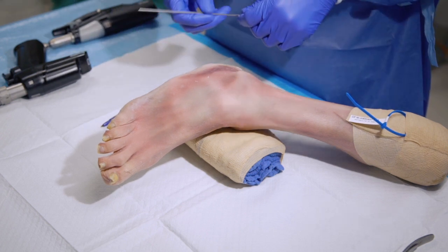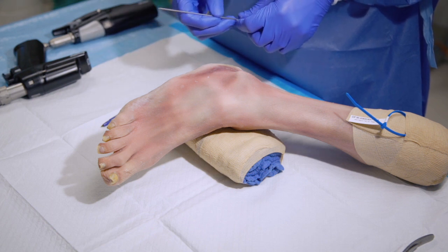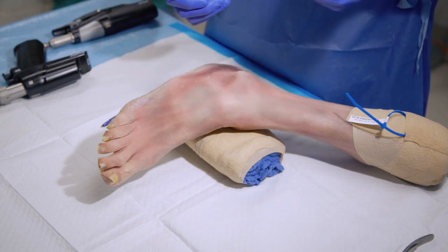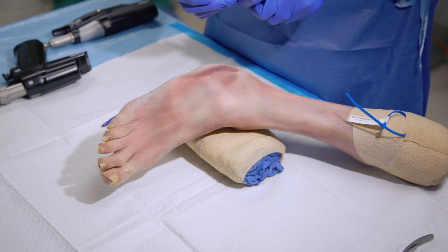One of the critical points to execution of screw insertion for a Jones Fracture is being able to get your starting point high and inside on the proximal fifth metatarsal.